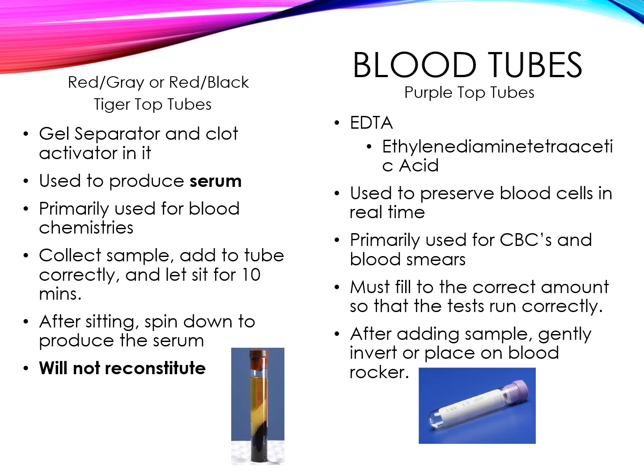And EDTA is also used to preserve cell morphology. So it is what we use when we're reading a CBC. So when you make a blood smear or you run a CBC, you're using an EDTA purple top tube. It is otherwise known as the hematology tube.